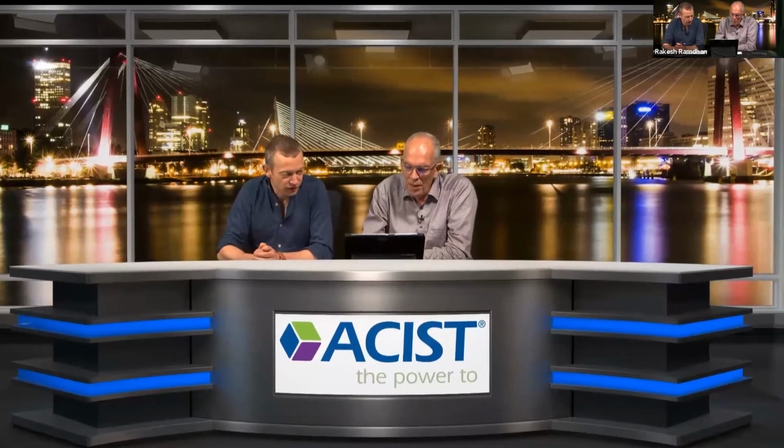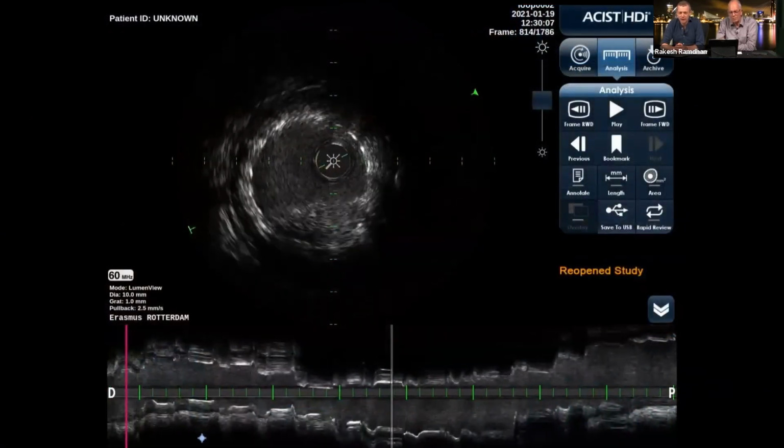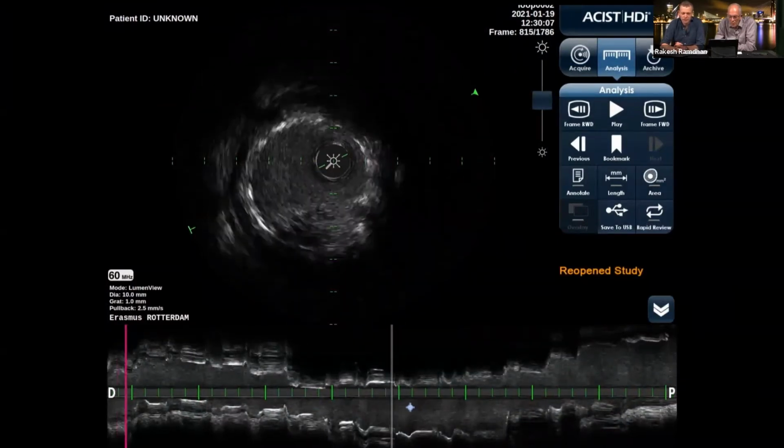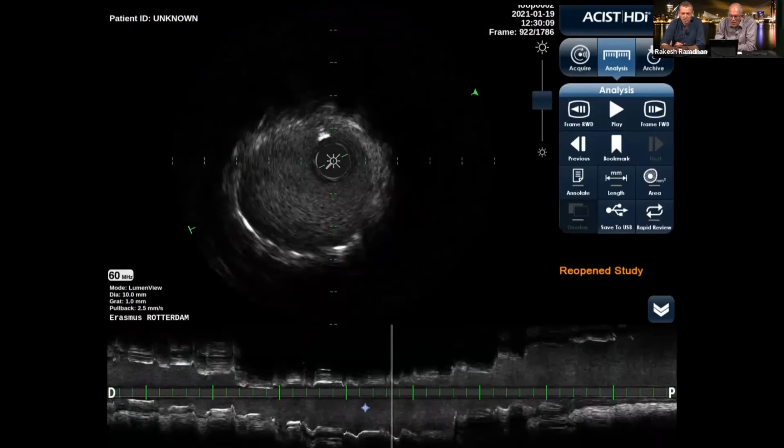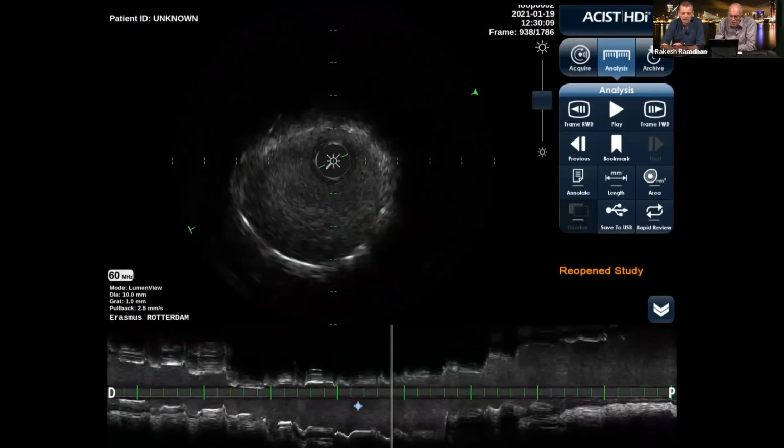And if you go back to the part where the thrombus is, you can see one nice thing now, because the thrombus is pushed aside. In many occasions, you can actually see the vessel wall. And I think here, if you go to the largest part where the probably biggest positive remodeling was, if you would measure that, you would measure around 5 to 6 millimeters. Maybe you can just do that for the biggest one in here. Yeah, where you can see the vessel wall.